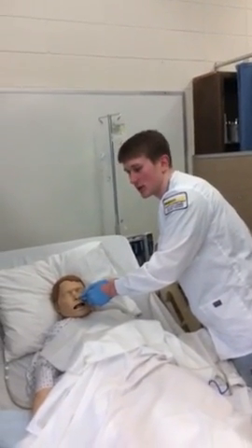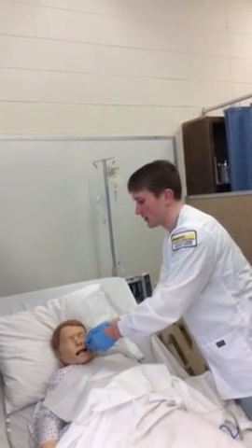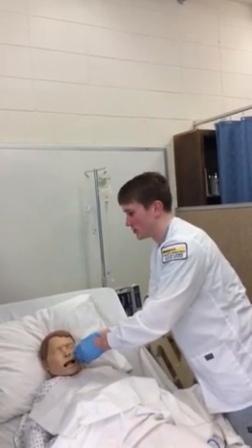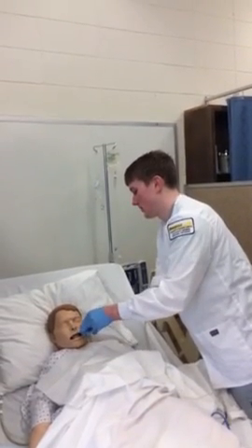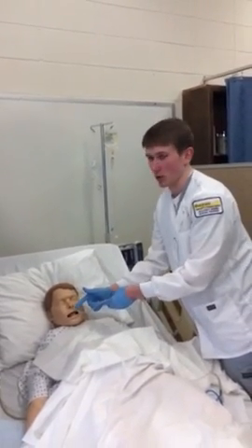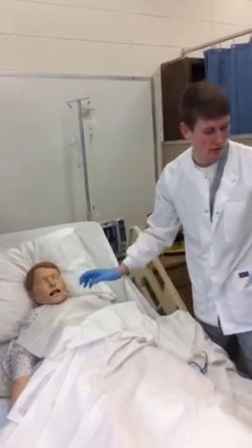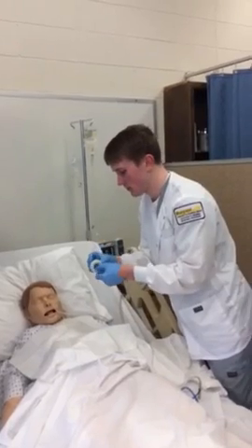Once they give me the stop sign, I tell them to bring their head forward and tuck their chin just slightly and swallow the tube. Keep on trying to swallow the tube as I advance it 1 to 2 inches. So the tube didn't go all the way down on the mannequin, but I'll just bring it all the way to the marked site I made. And once I do that, get my tape.